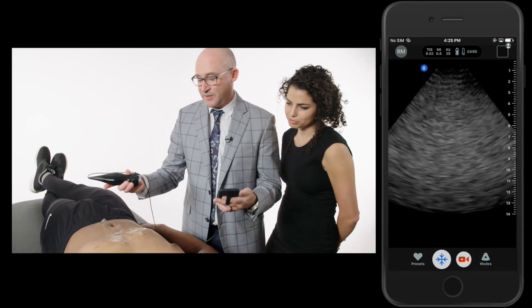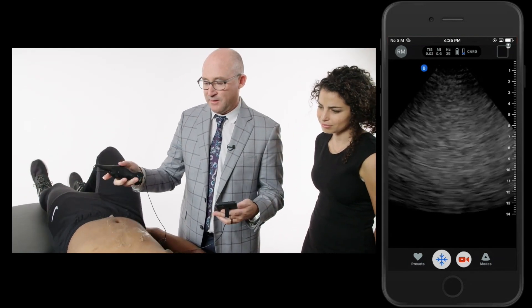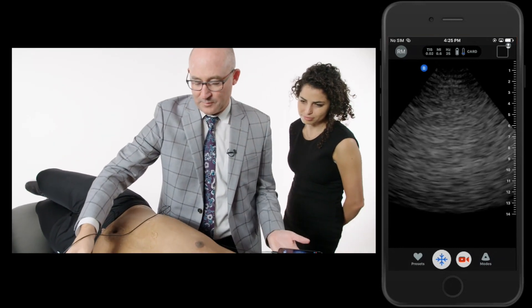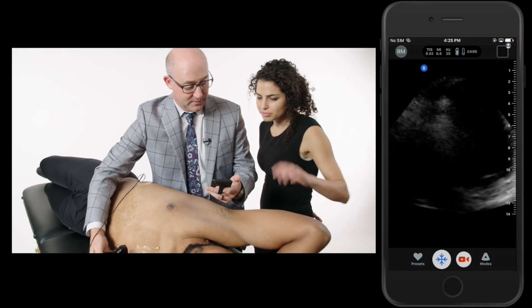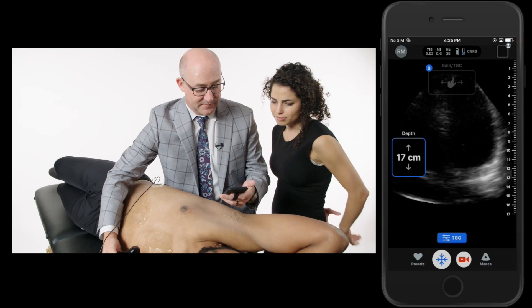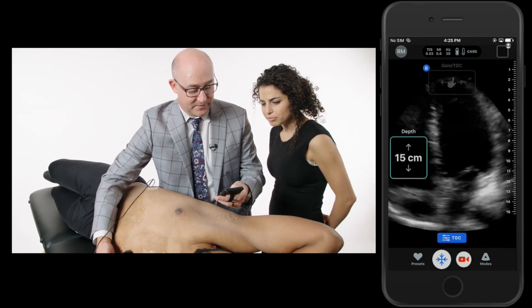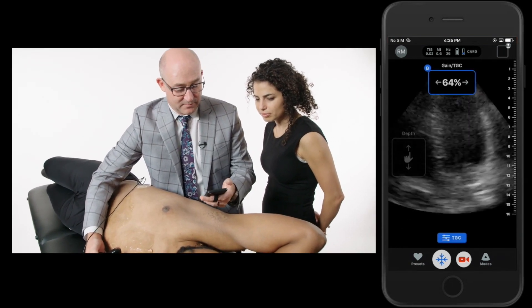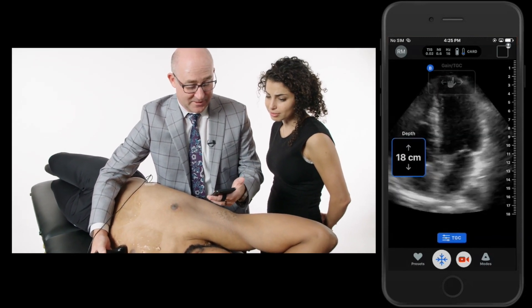I'm in cardiac mode, so I may as well just take a look at his apical four-chamber. If you could roll on your left side for me — just roll right over there. Here we've got a pretty good apical four-chamber view. Now we can see with 16 to 17 centimeters of depth — very easy to adjust the depth, just my thumb takes it up and down. And if I wanted a little more gain, I would just scrape to the right. It's really a good four-chambered view, actually.